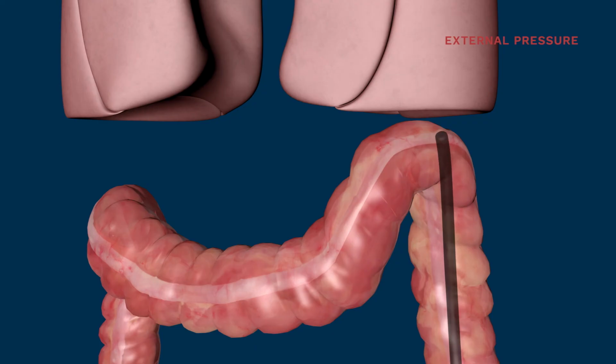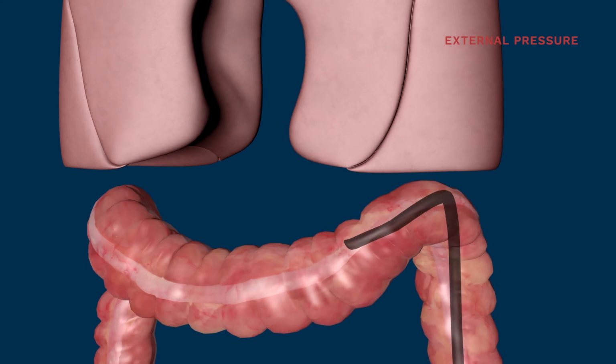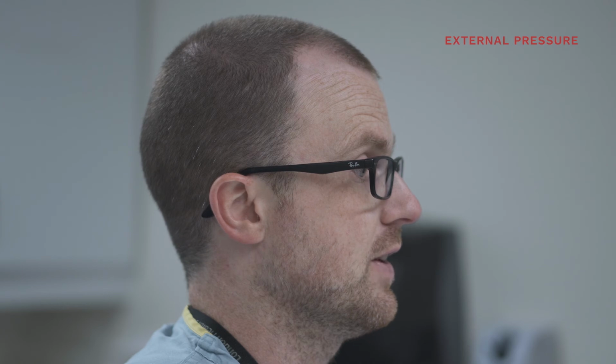The other form of external pressure that can be utilized is that of the diaphragm. In patients with a particularly high splenic or occasionally hepatic flexure, abdominal pressure is limited by the ribs. In this case, the diaphragm can help push against the scope. Patient instruction to inspire and hold their breath while the scope is advanced can be very helpful in this otherwise challenging scenario.